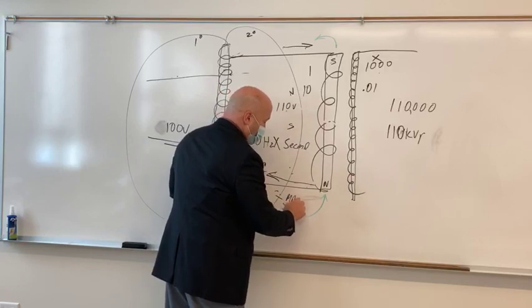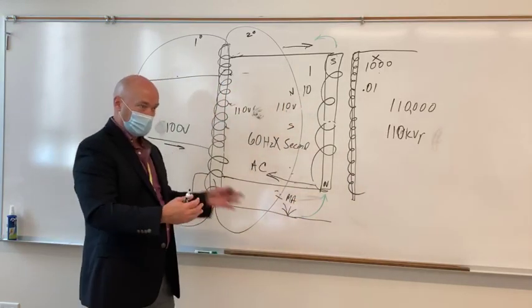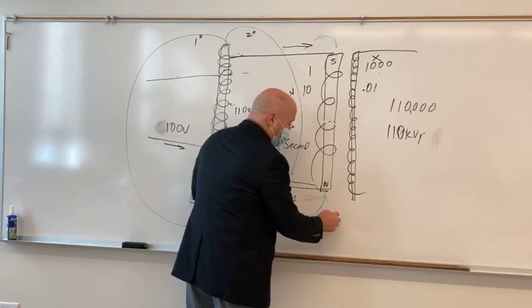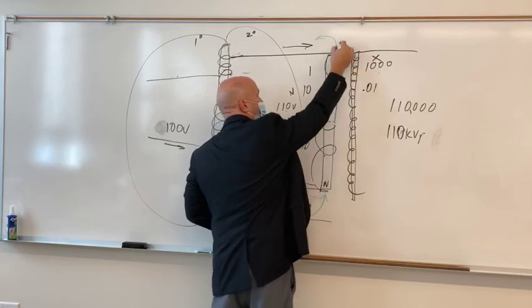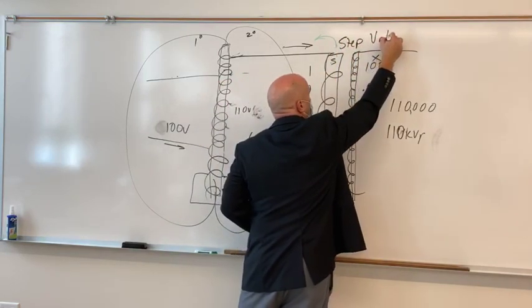And we've got an mA selector. After it goes through the mA selector and we select our amperage, in anticipation of it becoming milliamperage, it goes through a reverse of this. So as we change in a step-up transformer, it steps up the voltage.